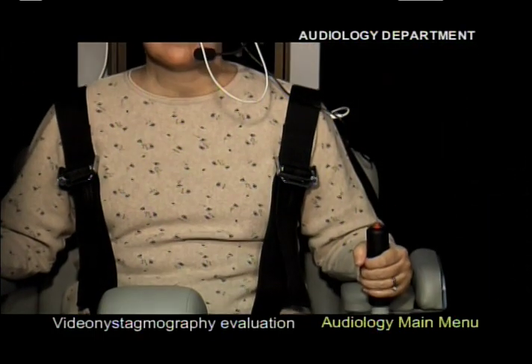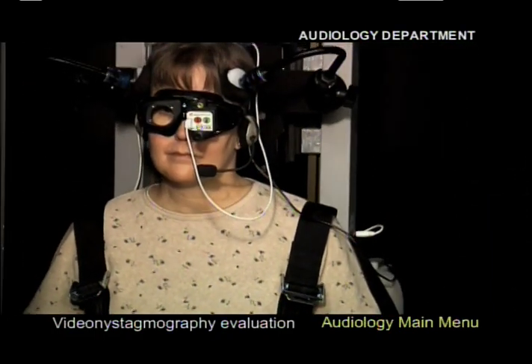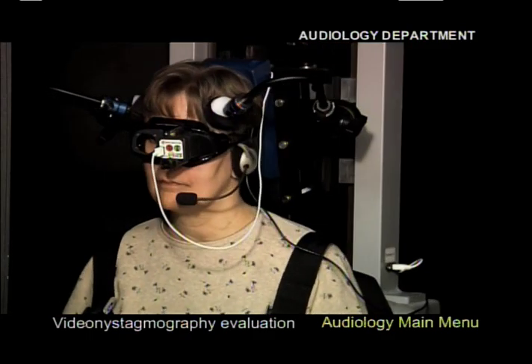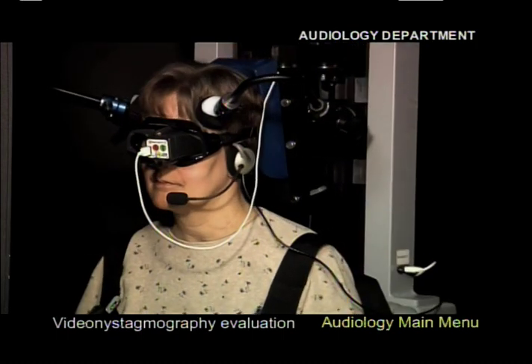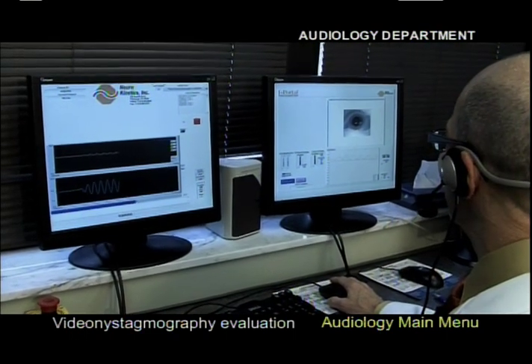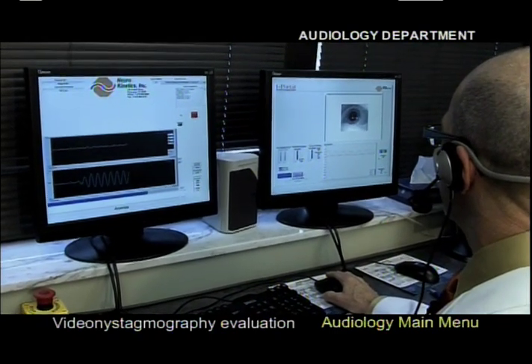The audiologist will first ask the patient to follow various lights projected on a screen or on the wall of the rotational chair room. This part of the test examines how well your eyes, vestibular system, and brain are working together to enable the patient to track moving objects. The purpose of this link is to keep your vision stable and focused on a target when your head is moving.